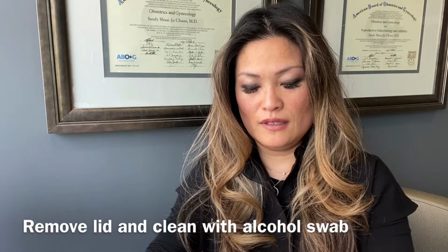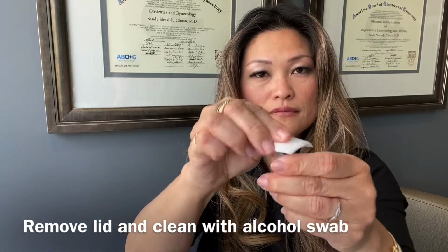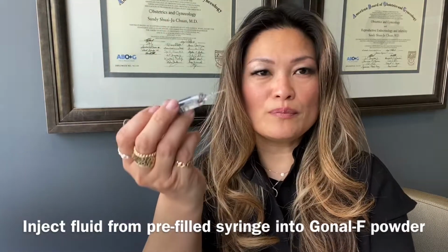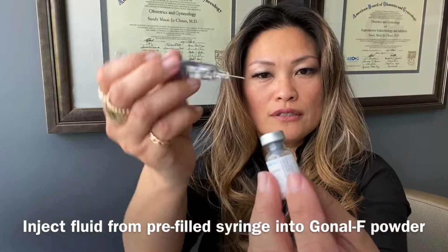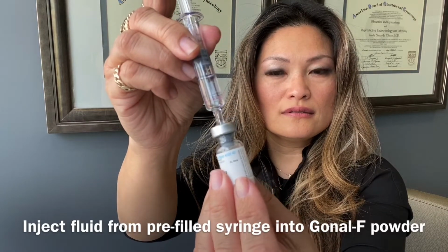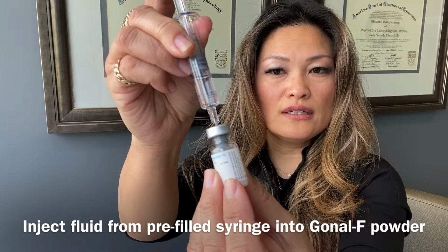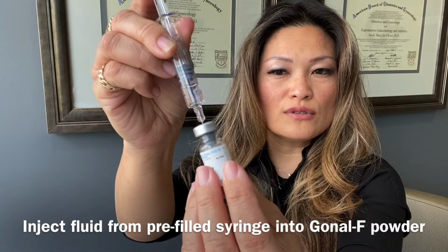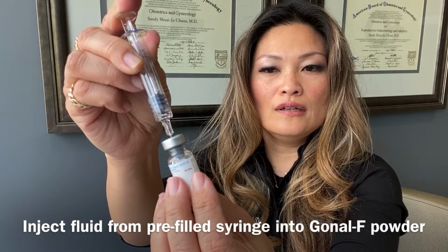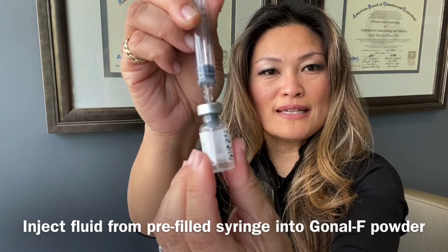So what you're going to do is take this Gonal-F vial, pop it off, and then just clean it. Okay, clean, clean, clean. And then you're going to take this, pull it open. You'll see that it might drip a little bit, no big deal. Take your powder and then just inject the whole thing in. It goes in a little bit slower because it's a really fine needle, so you just kind of want to shoot that in there. And there it goes. It's mixing up, okay?